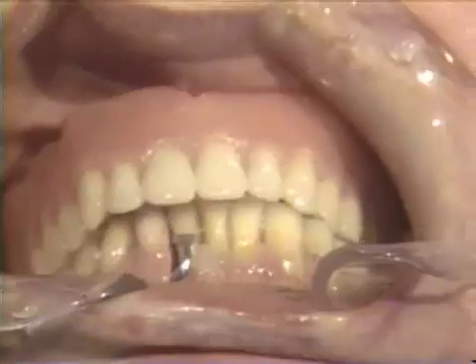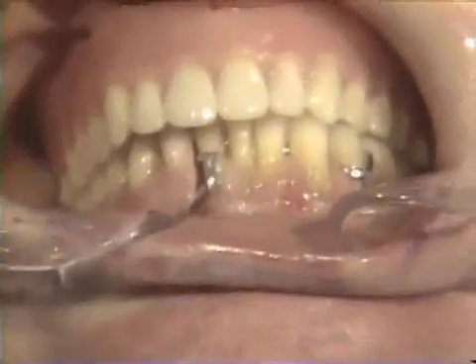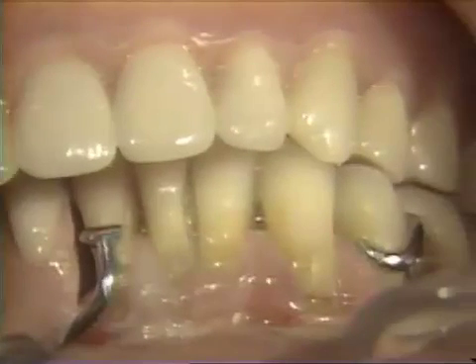The clinical results show the patient with a full upper denture and a lower partial. This case has employed the use of eight areas for composite addition. The technique is equally useful for addition of a small single area for prosthetic modification to all surfaces in the form of a full composite crown.